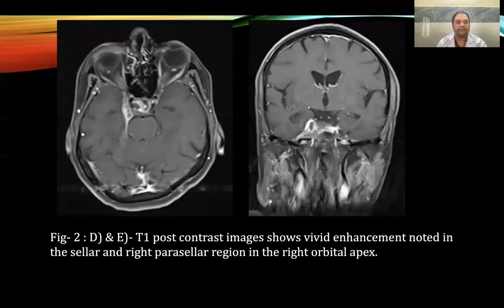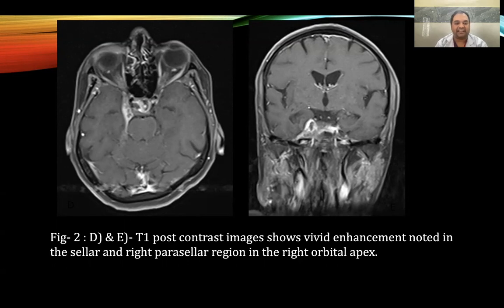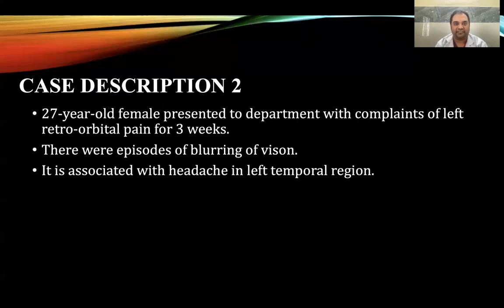Figure 2: D and E are post-contrast T1 images of axial and coronal cuts showing vivid enhancement in the sellar and right parasellar region in the right orbital apex.